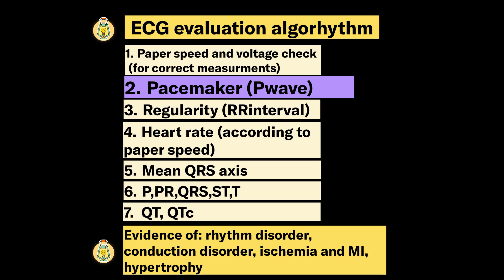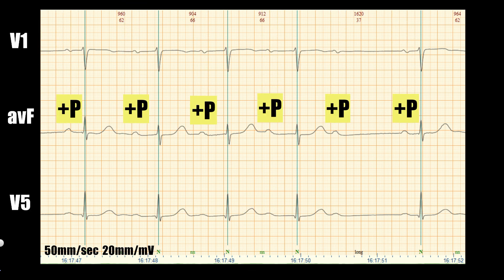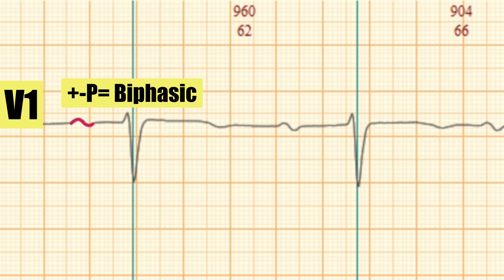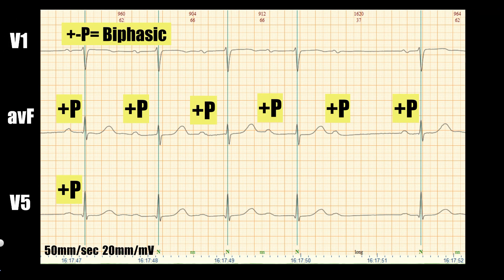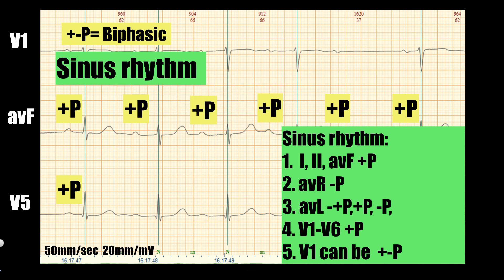The next step is the definition of the pacemaker, which means evaluation of the P wave. We see a positive P wave in AVF and a similar P wave in V5. In V1, the first part of the P wave is oriented upward and the second part downward — this is called biphasic. In sinus rhythm, the P wave is always positive in leads I, II, and AVF; always negative in AVR; any of biphasic, positive, or negative in AVL; and positive in all chest leads except V1 where it may be biphasic. As a result, in our case we have sinus rhythm.